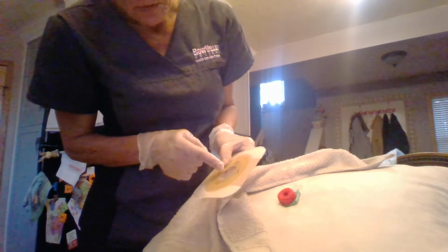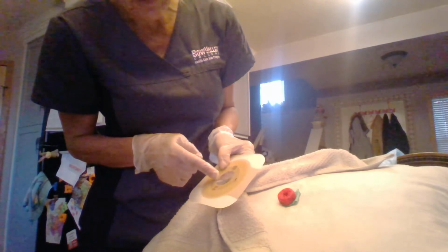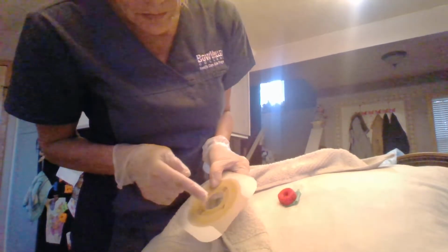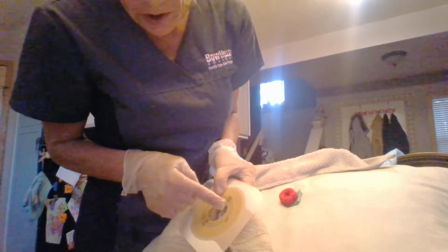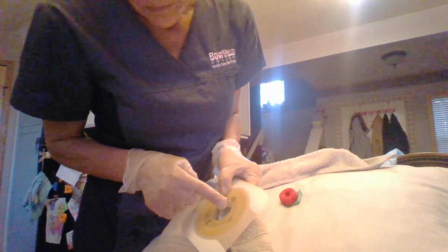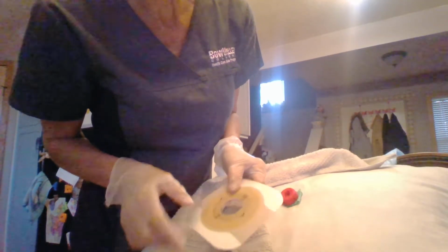So what happens is, when you're cutting this circle, try to always undercut the circle first to make sure that you really got a good fit, because a good fit is not when it's too big. You can always fix small, but not too big. When you cut a circle, if you cut little indenting cuts into the circle, it's easier to cut the circle. So you could do 1, 2, 3, 4 slight cuts to the size you need, or you could even do more into that circle circumference, and it would be a much cleaner cut. So mine was 38 millimeters, sorry.